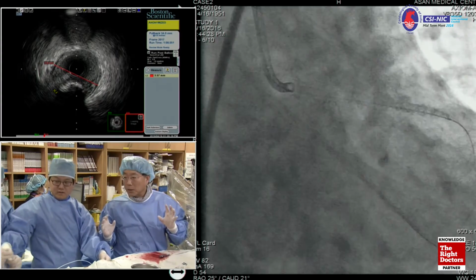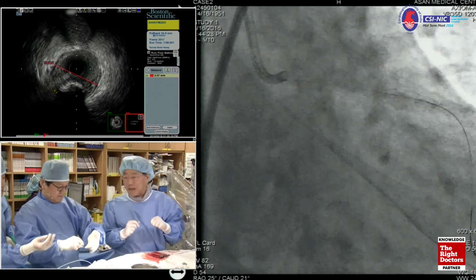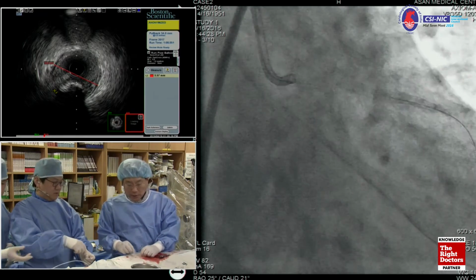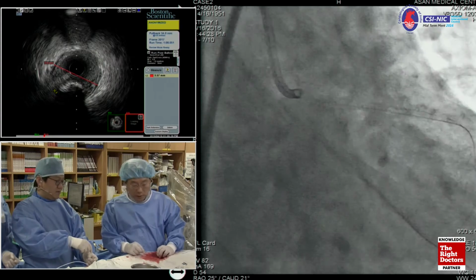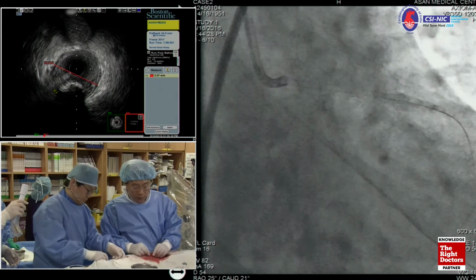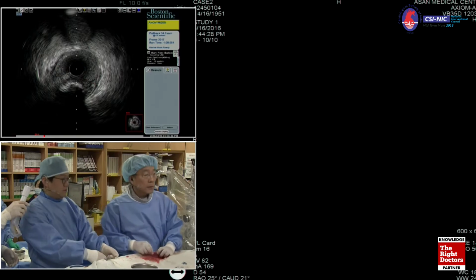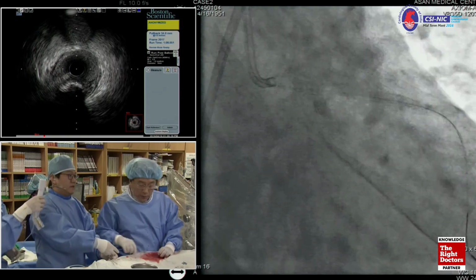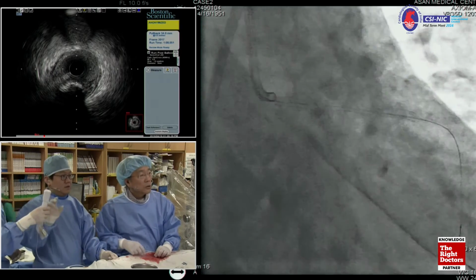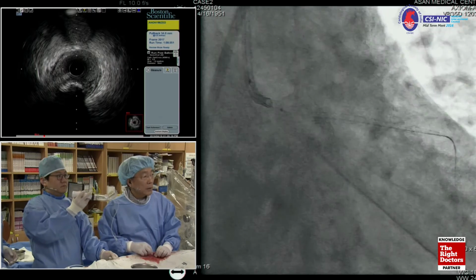It's kind of a part. Sometimes, proximal optimization, etc. So it's very difficult. However, high pressure, bigger balloon inflation can facilitate the second wire across the circumflex ostium. And then finally, Dr. Wan, you're going to do the high pressure inflation for the circumflex, and then final kissing balloon inflation, especially for the mini crush. We have no doubt that the final kissing balloon inflation is absolutely mandatory.